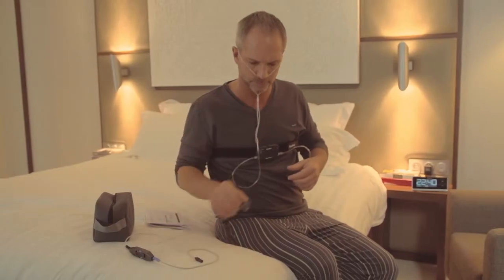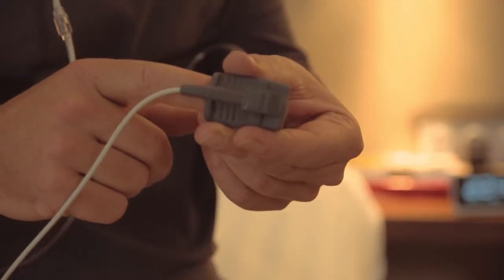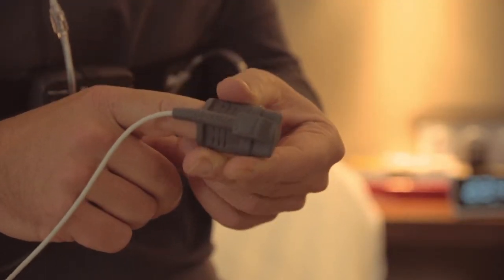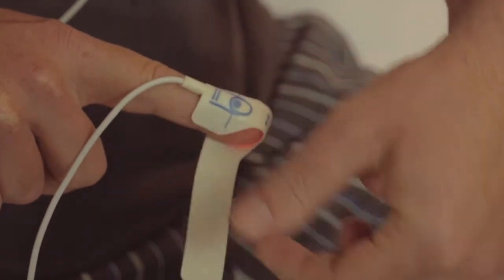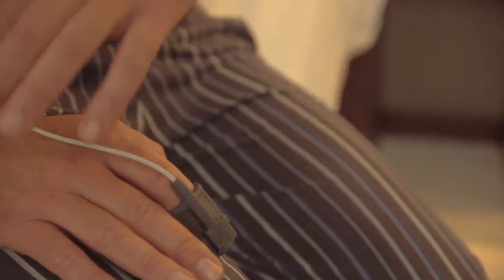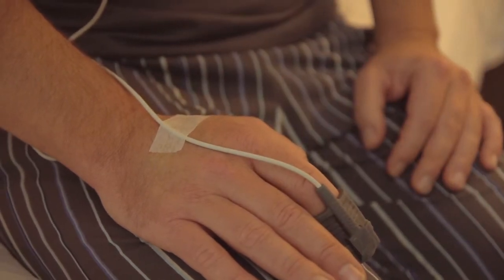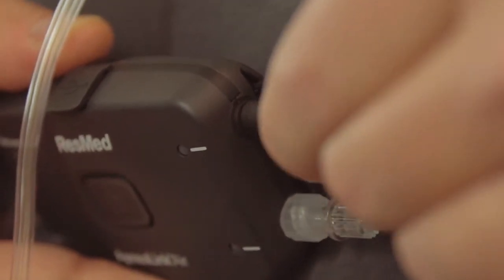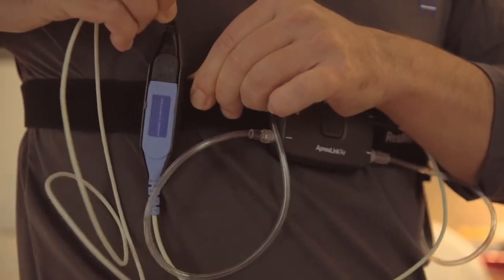The one remaining task is to connect the pulse oximeter device. Place the index finger of either hand in the sensor, or if you are using a disposable sensor, put on the adhesive and wrap it around your finger, as shown here. Secure the line using the tape supplied. You can then attach the oximeter to the belt alongside the ApneaLink Air recorder. If you're an active sleeper, you can also tape the nasal cannula tube to your cheeks.